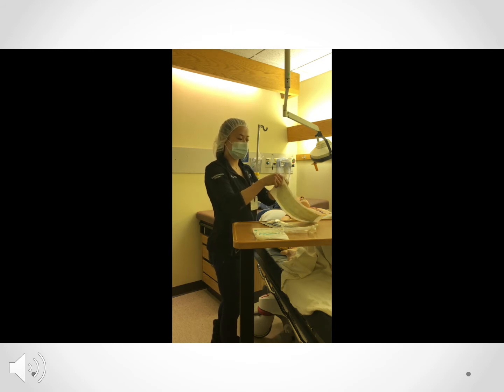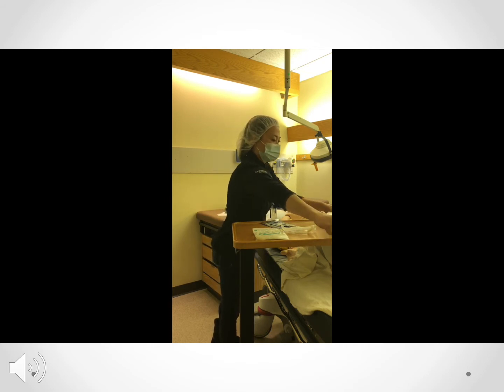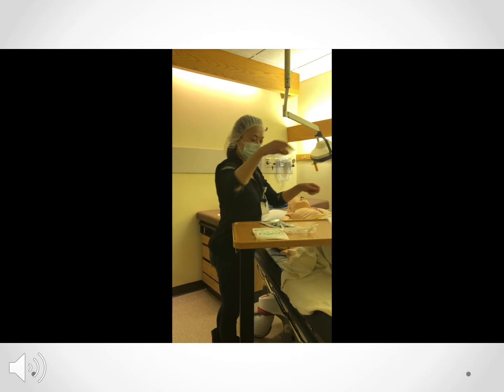So we open up the packages prior to putting on the sterile gloves so that everything remains sterile within the packages.